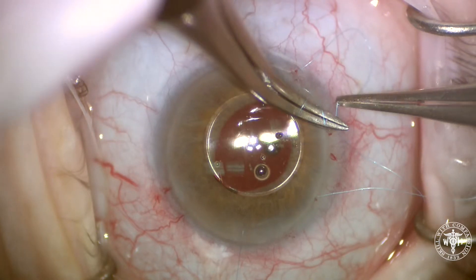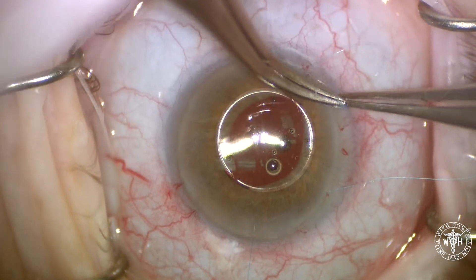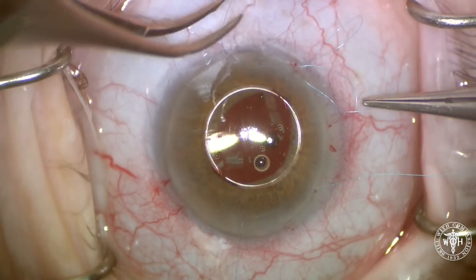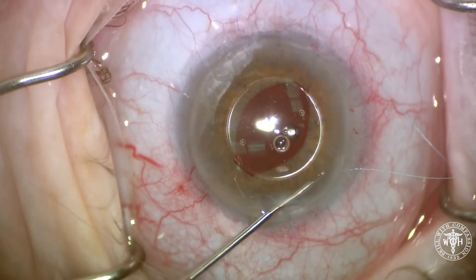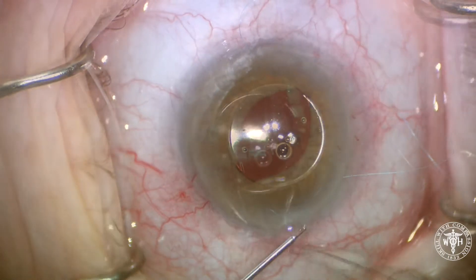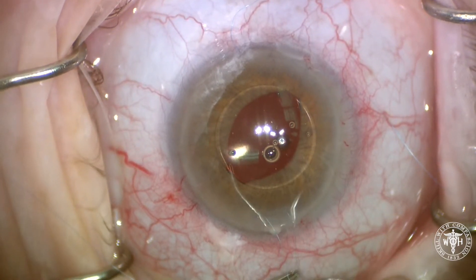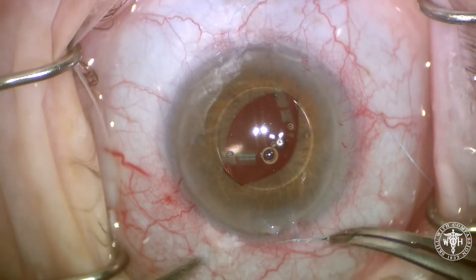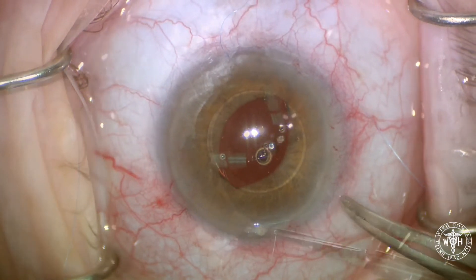Then tying a modified Siepser knot, we're going to secure that superior haptic in place to the iris. I have another video that I'll post pretty soon that really shows how to tie this knot. Now the second haptic we can tie slightly differently because I have the sutures coming out through my main wound — it just so happened that the haptic lined up with the main wound. So here we're just going to tie a more traditional McCannel style suture.